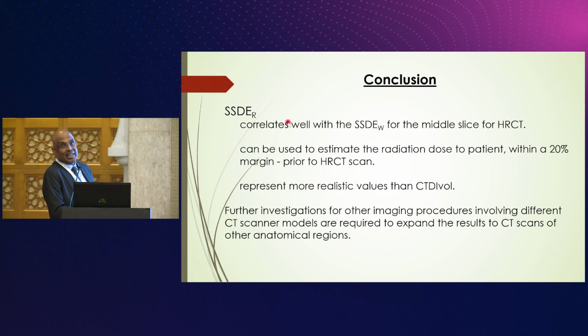Once you finish your scan, you can actually do this for the volume that you image. So therefore, that represents a much more accurate value of the patient exposures. So this is just a guide. It's a useful guide. You might be able to do risk-benefit analysis better than if you just use the CTDI volume, because that takes patient size into consideration. So that concludes my presentation today.